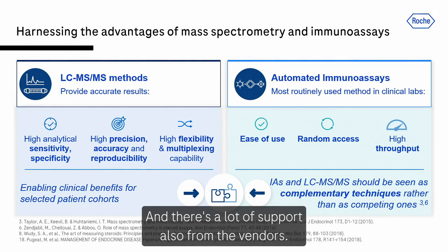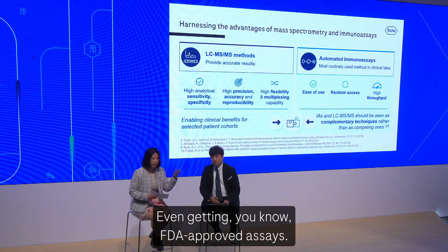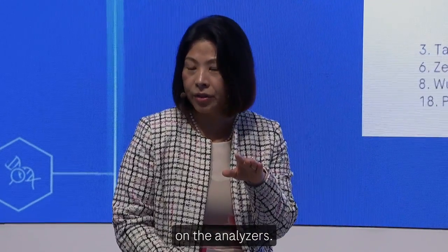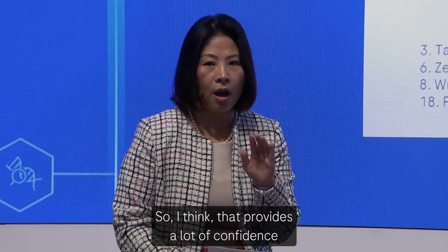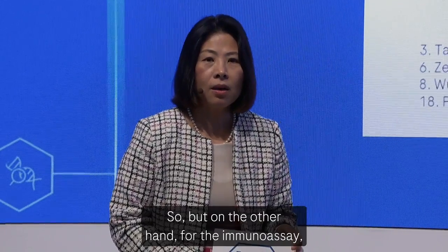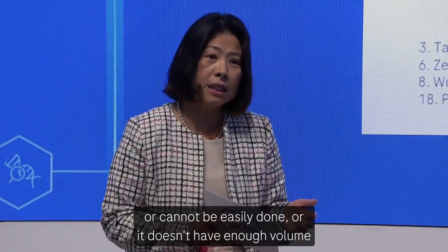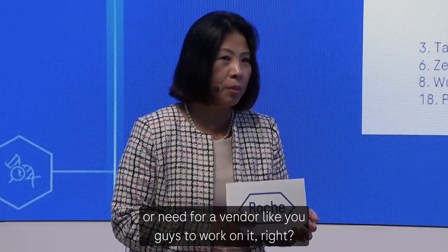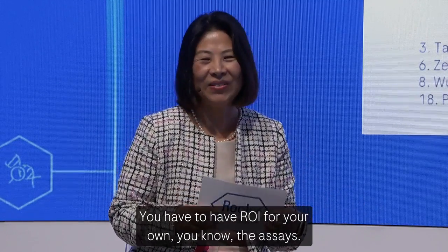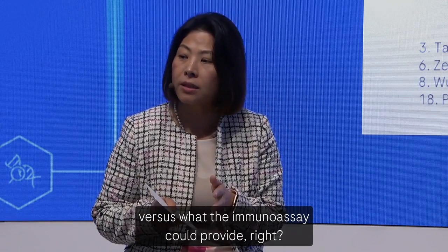And there's a lot of support also from the vendors. I know you guys do a phenomenal job when you help customers, even with FDA approved assays. The majority of them, I think, are FDA approved assays on the analyzers. So I think that provides a lot of confidence and ease of use for the customers. It's like off the shelf, you can do it. But on the other hand, for the immunoassay, there are some things that cannot be done or cannot be easily done, or it doesn't have enough volume or need for a vendor like you guys to work on it. You have to have ROI for your own assays. So there is a gap between the patient's needs and what the immunoassay could provide.